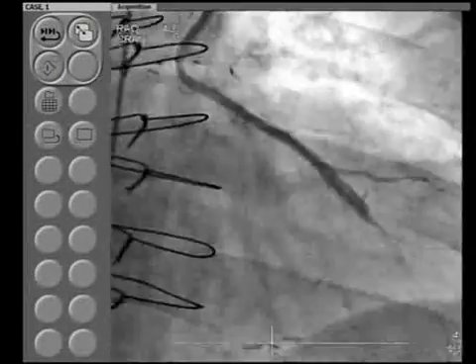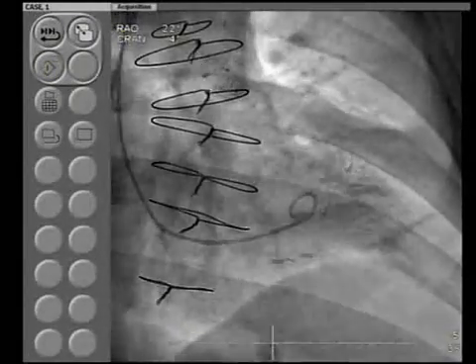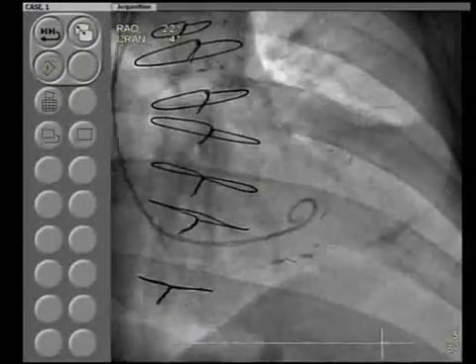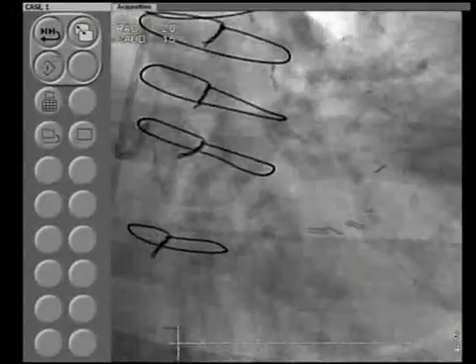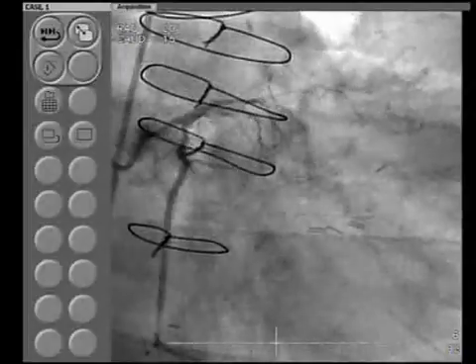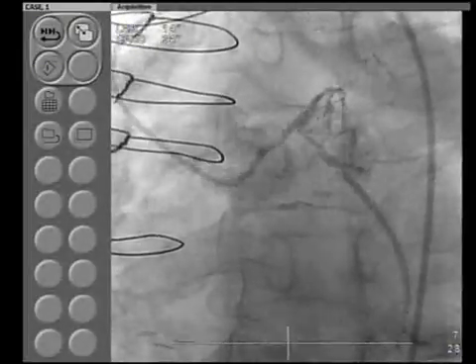The long segment of the distal diffuse disease, you can see here, and LV actually has improved significantly. It was 40% last year, now I would call it 50 plus. Yeah, there's a mild LV dysfunction, and this is the vessel in question. Left main with the angulated circumflex, and you can see the stump of the OM.